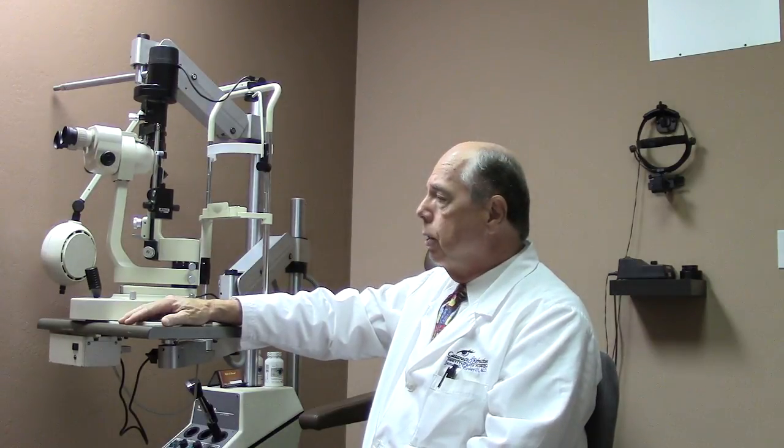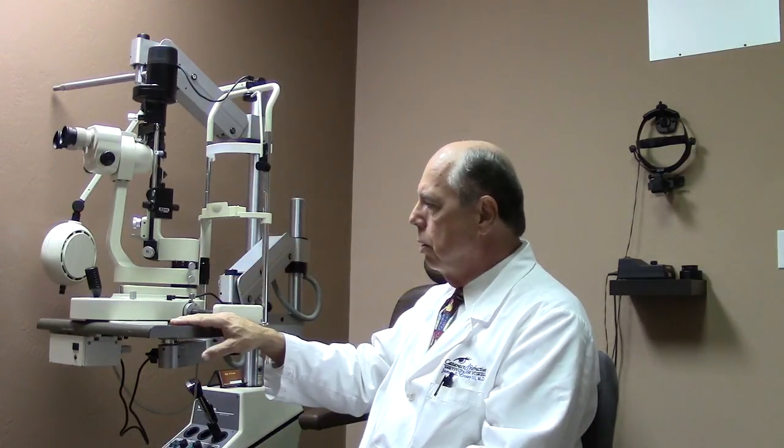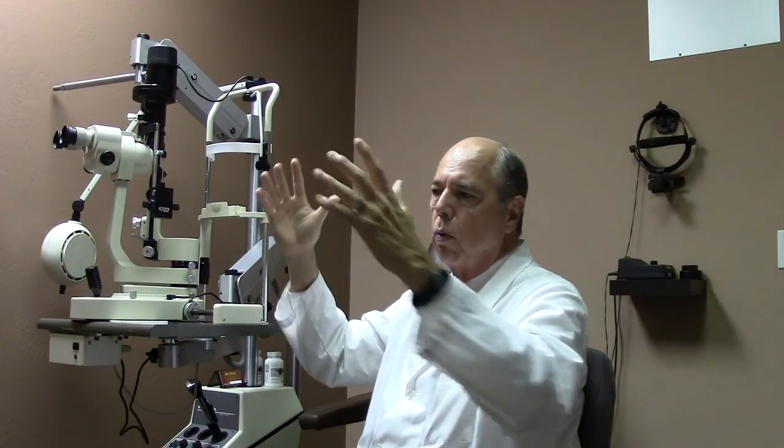So the slit lamp is the main instrument we use to examine your eye. They're not cheap — they can be very expensive to purchase. Ophthalmology is probably one of the most expensive types of medicine to practice, because all the equipment in the exam room adds up to a significant amount of money. There are also different lights we can use, and we can change the size of the slit beam from narrow to wide in different ways using controls on the slit lamp.